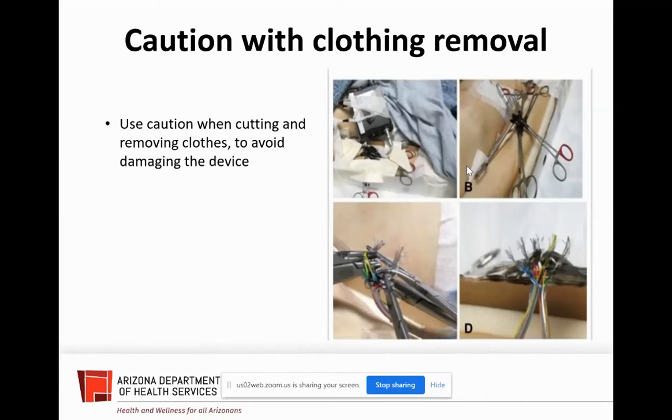We're going to decide if we need to start CPR, because CPR is absolutely indicated in these patients if their device is off. Okay. That changed in the American Heart Association's 2018 guidelines. And I believe the guidelines for you guys have changed as well. So that's our hospital policy, and we will encourage you to do CPR if that patient is unresponsive and their LVAD is off. All right.